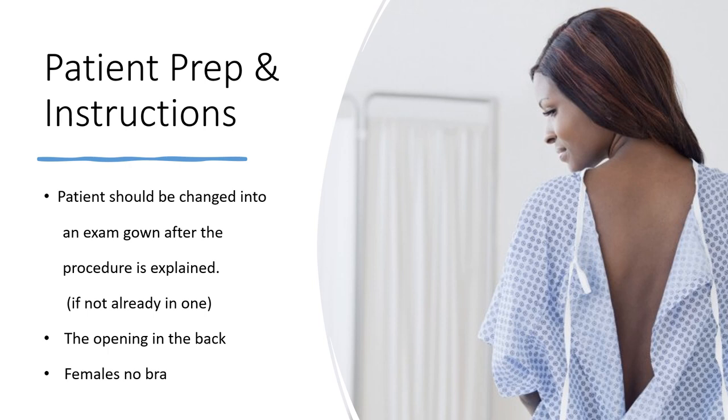It will stain. Have the patient use the restroom prior to the procedure because it could take quite a while for us to do our procedure, and then they get sent over to CT and they do their procedure, and they want to keep the patient laying flat, semi-erect, with their head up. So you want to have them use the restroom now.